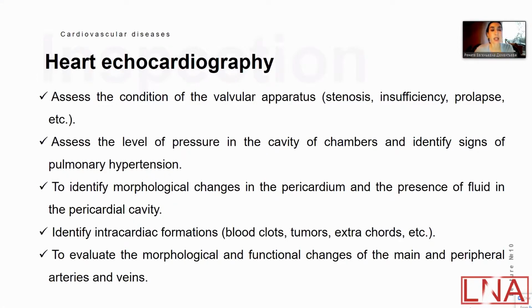of the heart. We can evaluate the morphological and functional changes of the main and peripheral arteries and veins, including the main arteries and veins surrounding the heart.